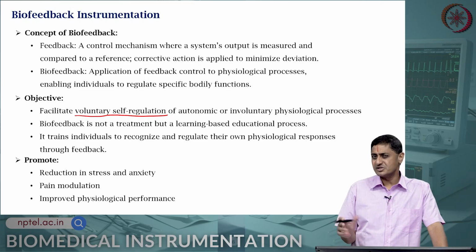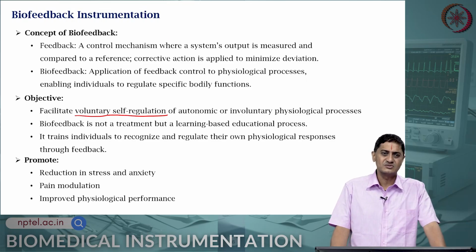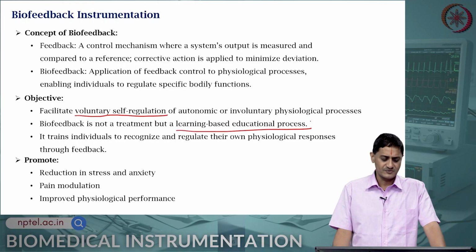So, what you are measuring is an involuntary process, but it is possible for you to modulate or regulate this process. So, biofeedback is not exactly a treatment, but a learning based educational tool. It is a tool.